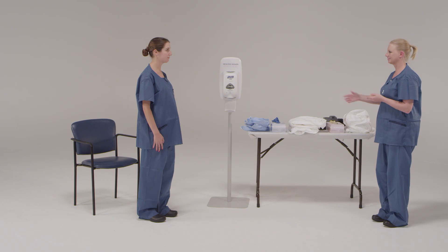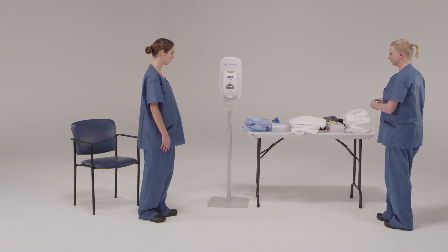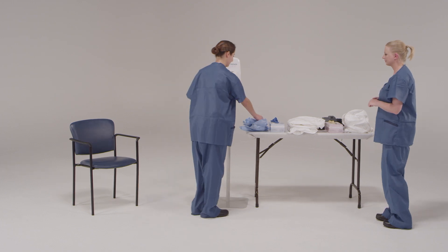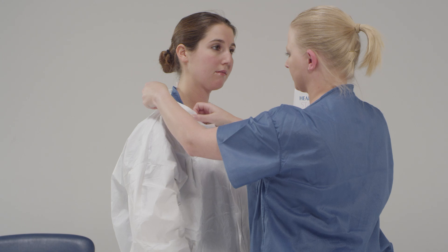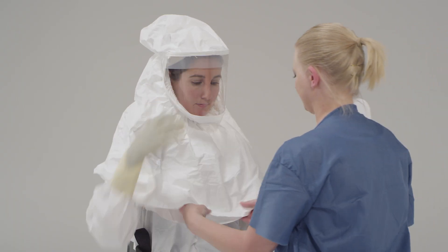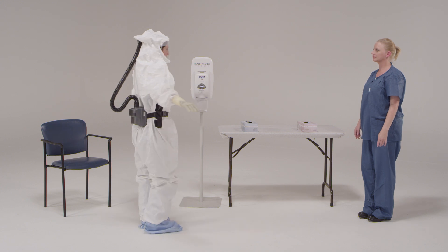Ideally, as the observer, you tell the health care provider what step to perform. They verbalize back the task to ensure they understood, and you, as the observer, verbalize completion. Completion means a thorough check that every part of the health care provider's personal protective equipment is in place, intact, fits properly, allows freedom of motion so your colleague can do their work, and is positioned to ensure all skin and hair is covered.